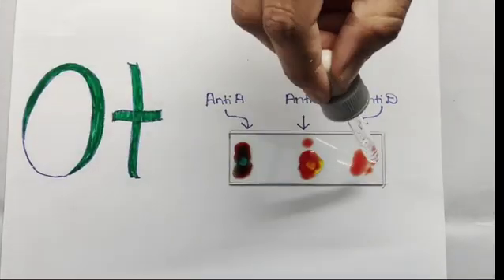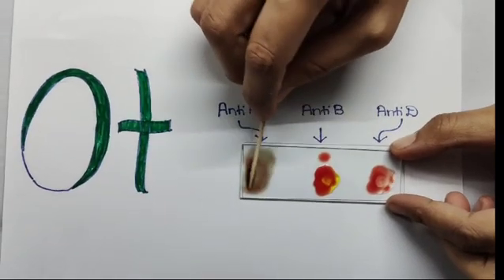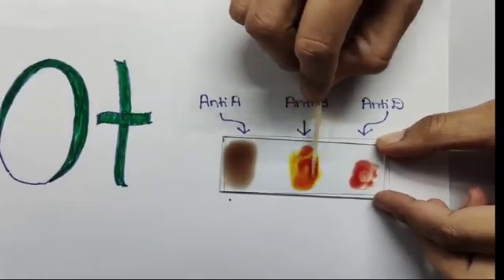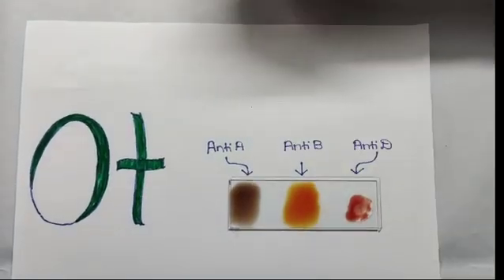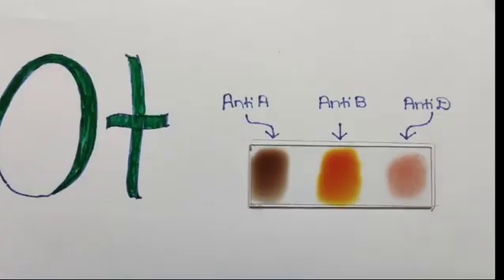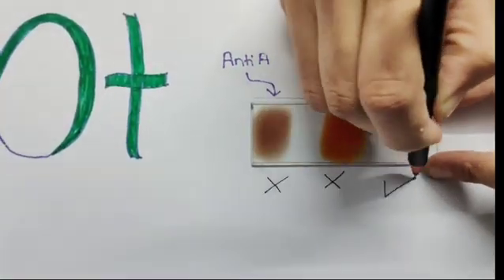Here, only clotting is seen in anti-D, which means Rh antigen is present. It is a positive blood group. Hence, the blood group determined is O positive.